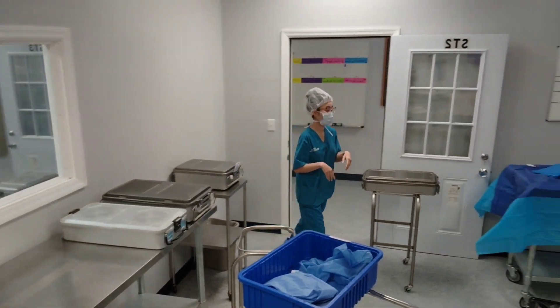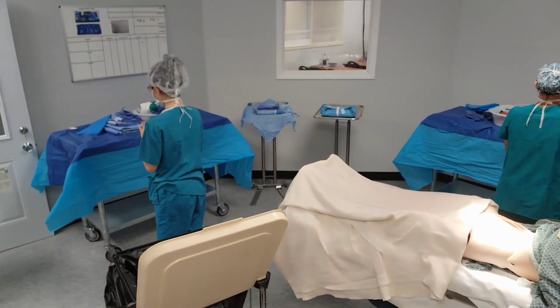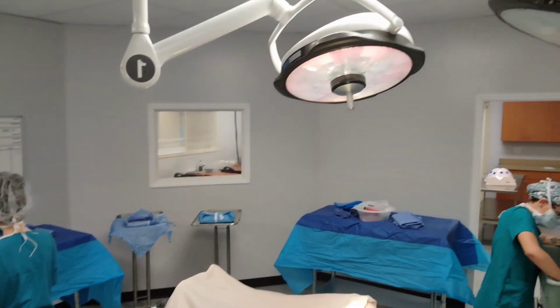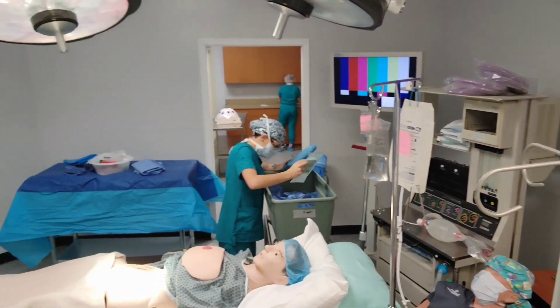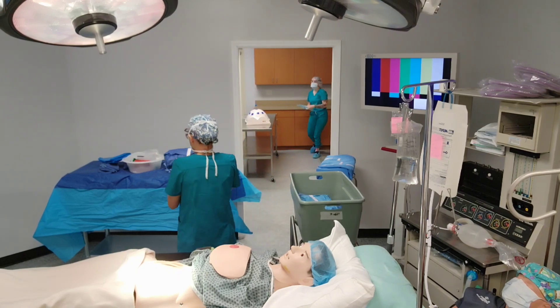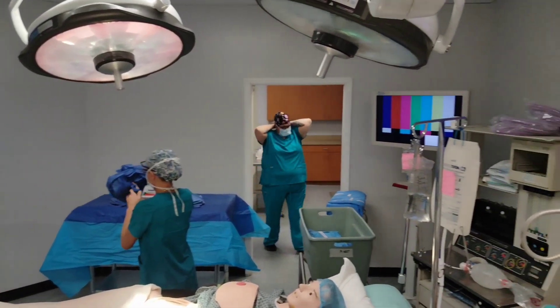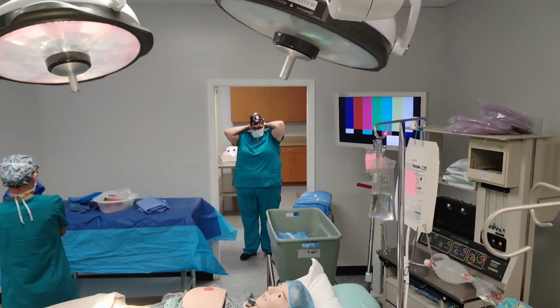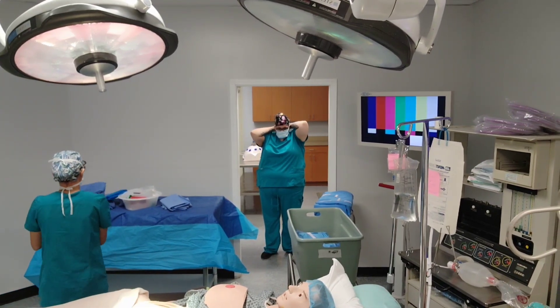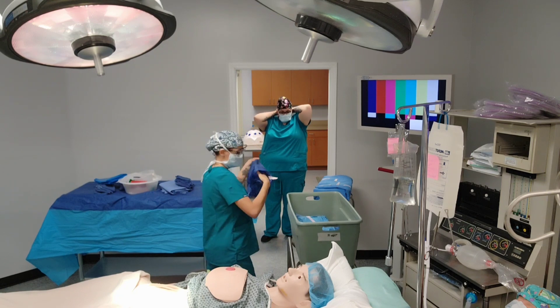Isn't that its job? It's following you. This camera wants you to be close to the field. Do you know what else needs to be open? Are you good with this field? Yes, all right. Do you have a gown and glove for yourself? Yes. Let me hear what you're thinking — I can't hear you thinking. I'm just going to see the back on the other side. I love it. Do you have a hypo? Do you need a 10cc hypo, she's asking? Do you have a syringe or any blade? Get to that field, verify, and then let Kim know anything you might need. Reagan, are you okay with communicating with Taylor? You're going to be working with her. Outstanding.